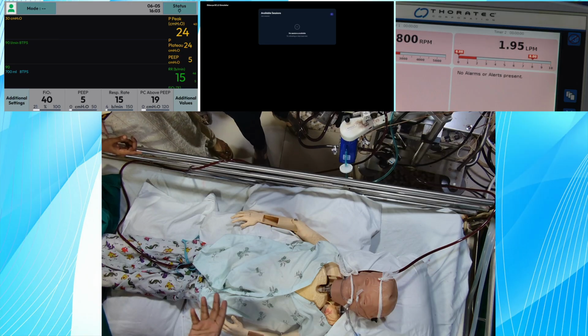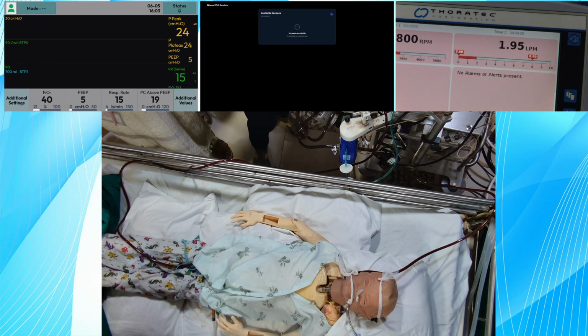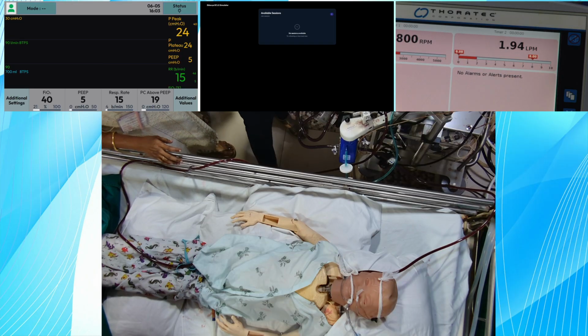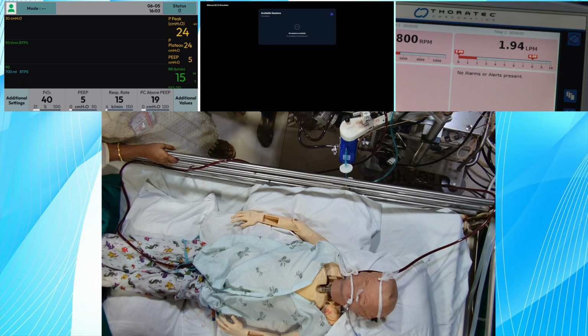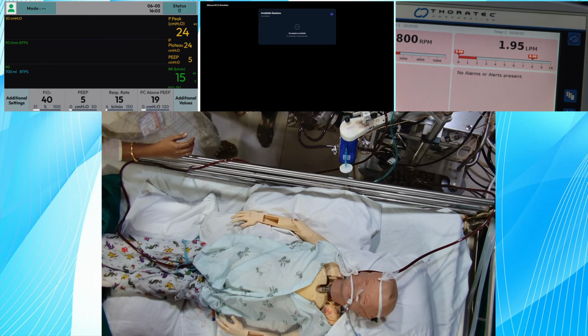Machine, we have the oxygenator because pre and post membrane it is the same. Yeah, so there is something wrong with the oxygenator. And we have checked for clots. If there are clots, then we need to change the oxygenator. Get ready to change it.